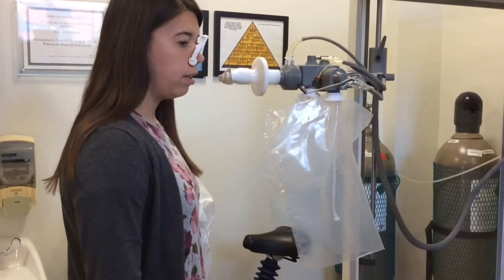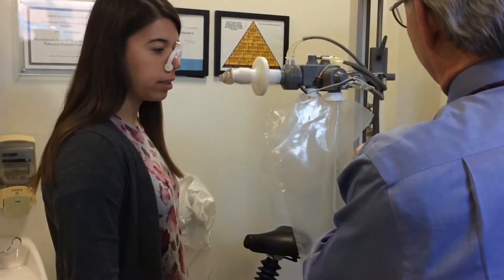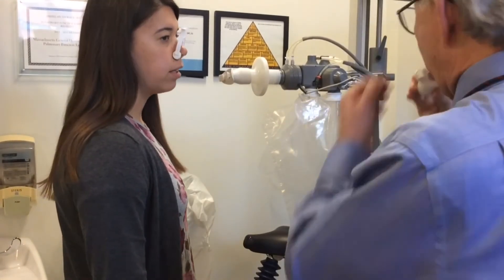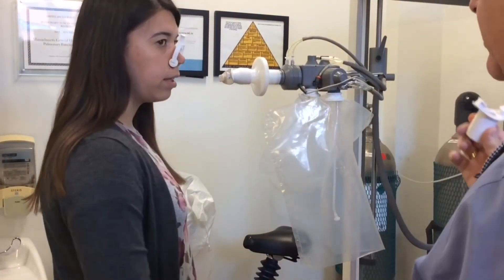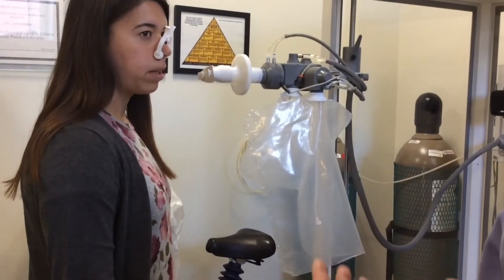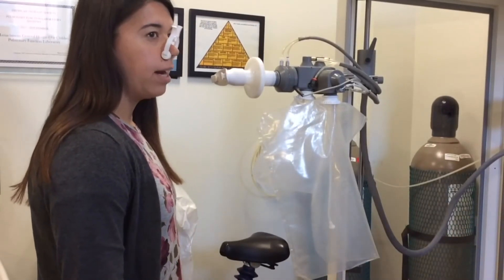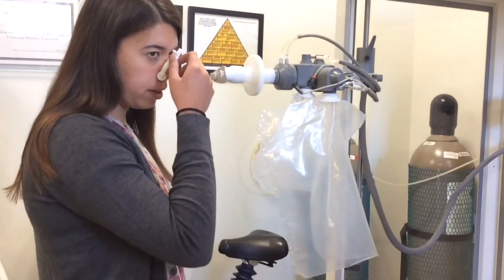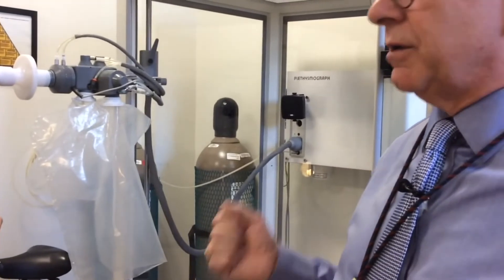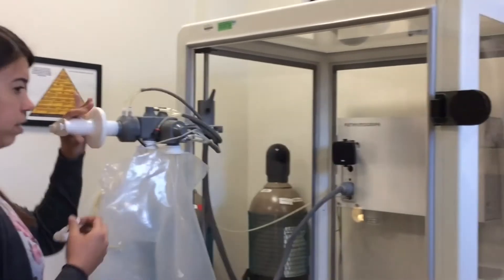I have a demonstration mouthpiece and I'm going to tell her: this is what I'd like you to do — teeth and gums against this wall, lip over the flap, start off on the side, just slide it in your mouth. Clips are on. You're going to take a couple of easy breaths, then I'll say take a deep breath in, big full inspiration, big chest — just like at your birthday party, blow out one breath as fast, as hard, and as long as you can. The technician or respiratory therapist running the test will also provide verbal encouragement as they go along.